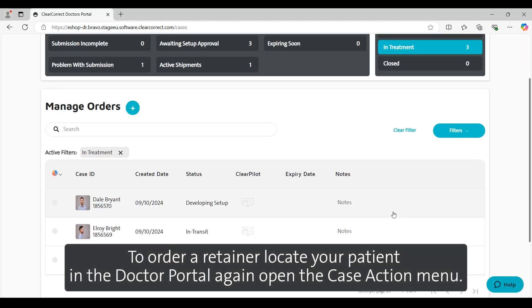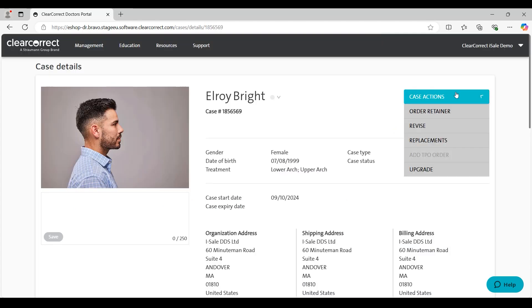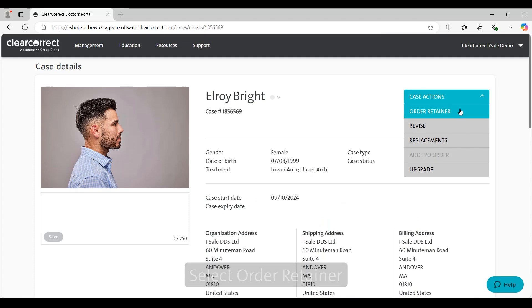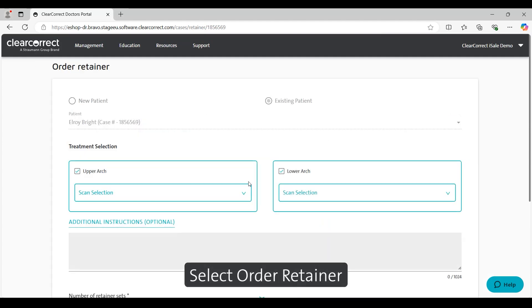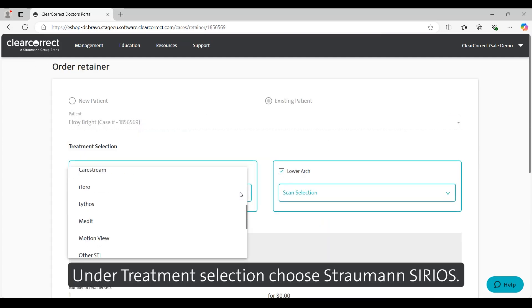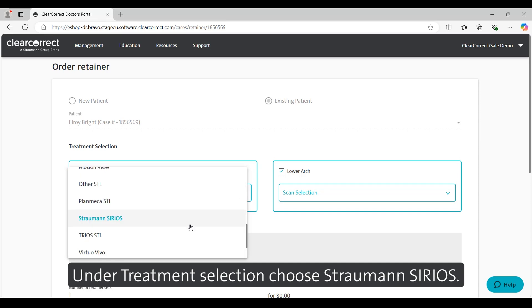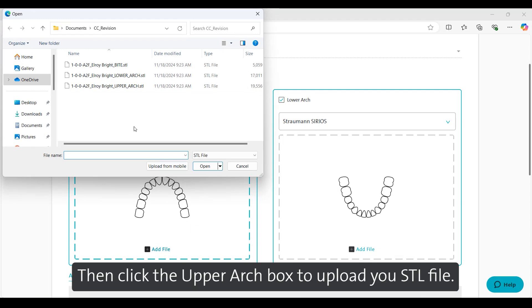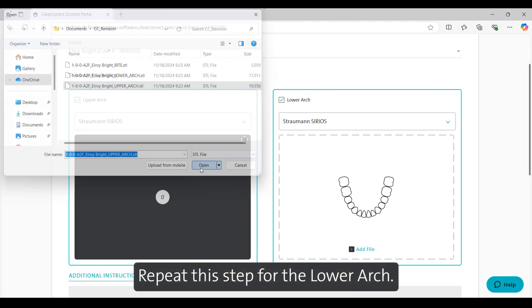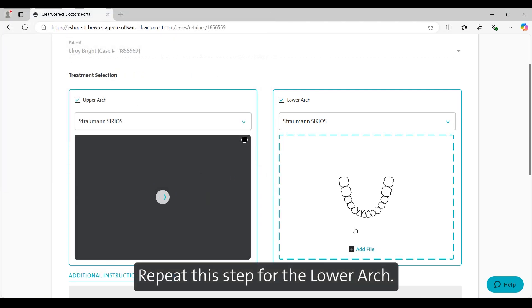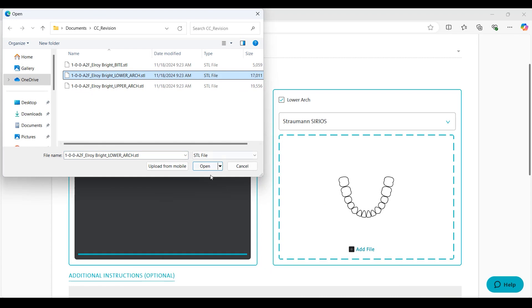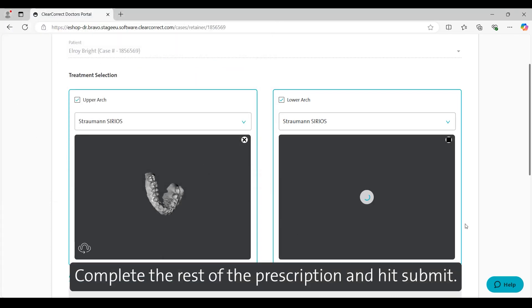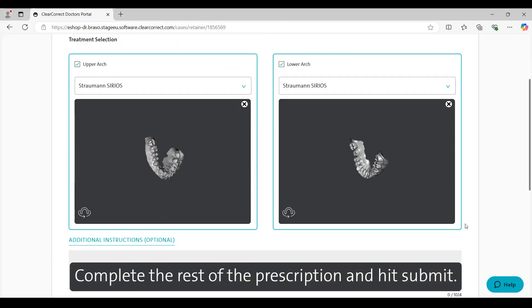To order a retainer, locate your patient in the Doctor Portal. Open the Case Actions menu and select Order Retainer. Under Treatment Selection choose Straumann SIRIOS. Then click the upper arch box to upload your STL file. Repeat this step for the lower arch. Complete the rest of the prescription and hit Submit.